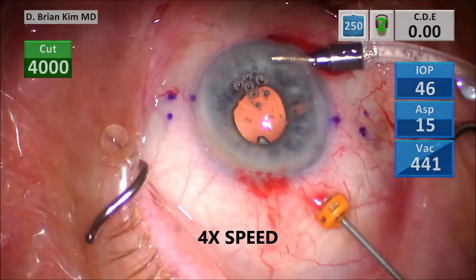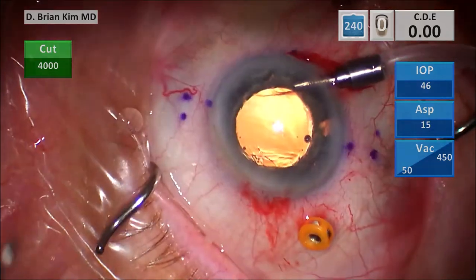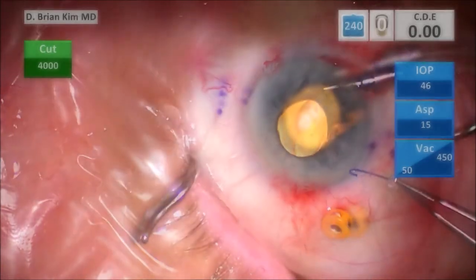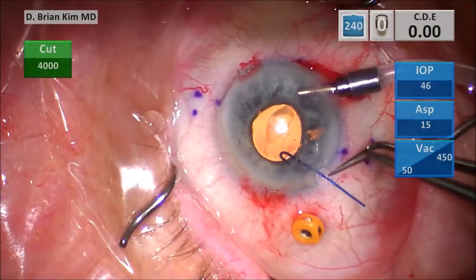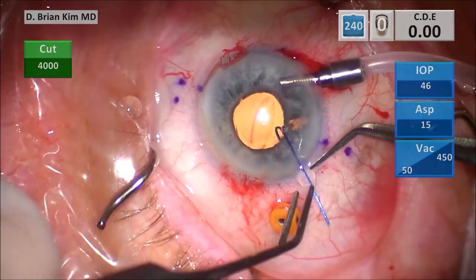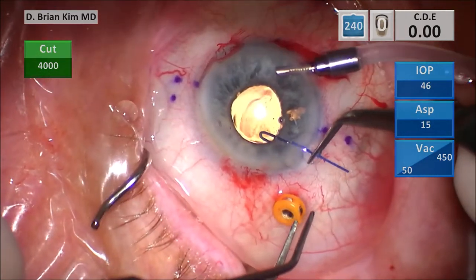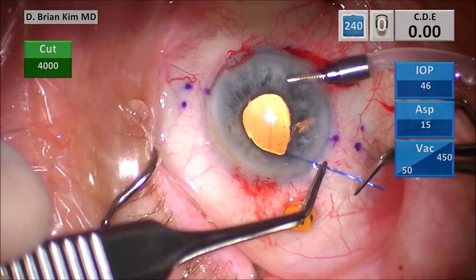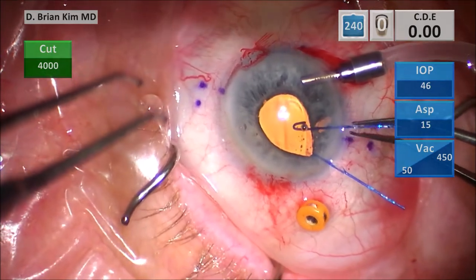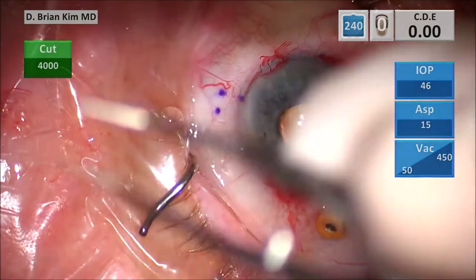I did that at 4x speed just for time's sake. I inflated the eye with some more viscoelastic, and since the pupil was small I made some more stab incisions. Whenever the pupil is small, I don't hesitate to place iris hooks, because when you're trying to cannulate the haptic through the needle you shouldn't be struggling with your visibility. Hooks are a little annoying but very helpful. I place it through, make sure it's pointing down, hook it, then pull the sleeve down — the stopper holds and secures the iris hook in place.